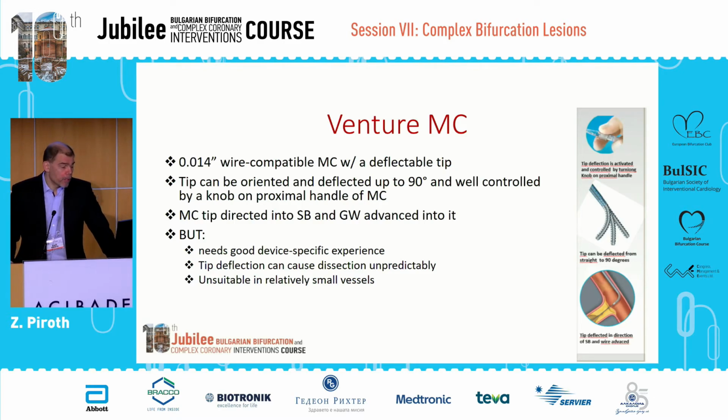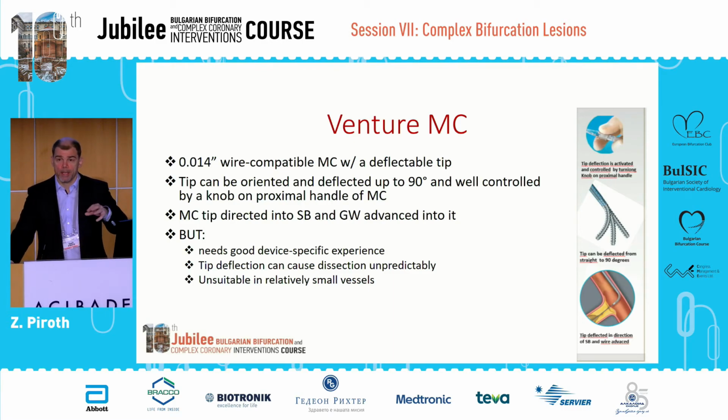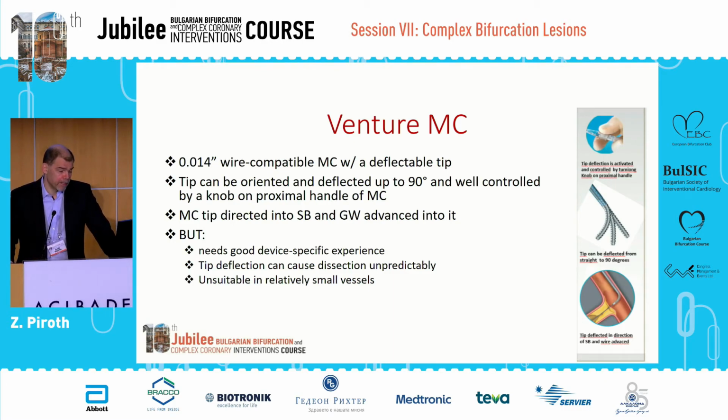But it needs a very good device-specific experience. And of course, the tip deflection can cause dissection in an unpredictable way. And in this case, it is extremely important to check from different projections whether we are entering the true lumen of the side branch. And of course, it is unsuitable for relatively small-sized vessels because you need some space for the tip to be deflected.